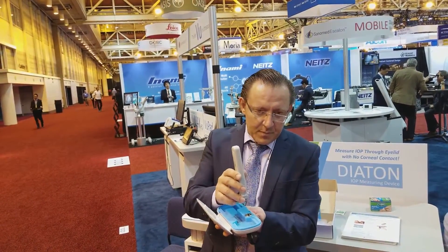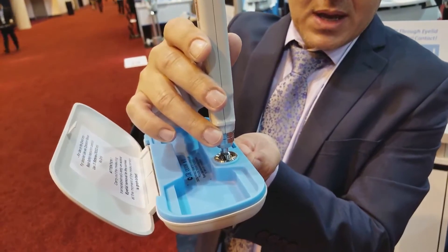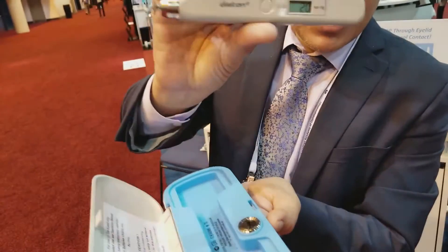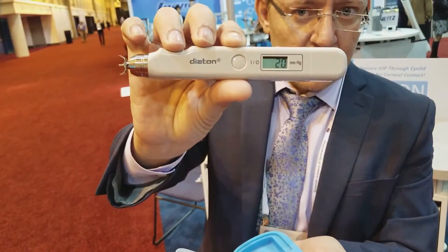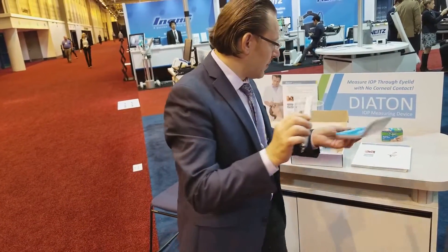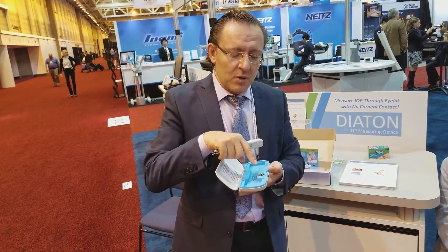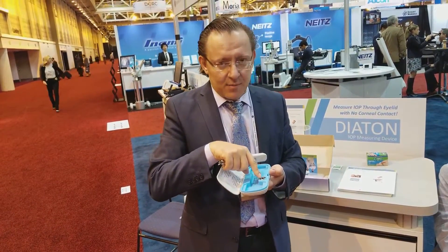The calibration tester has two little indents. Position the device and take a quick measurement — it should read plus or minus one of 20 on the display, meaning the device is ready to work with. You can also practice a few more measurements on the calibration tester.